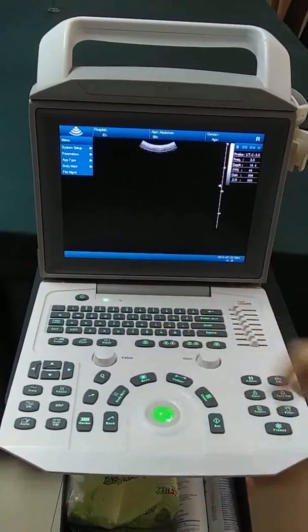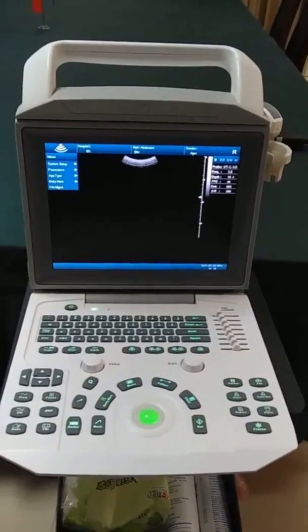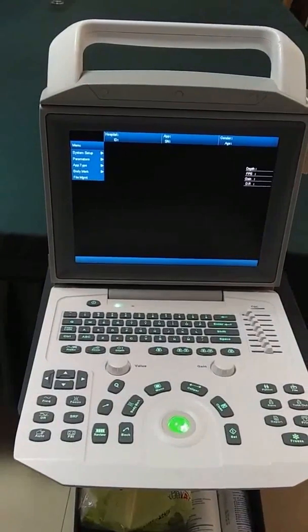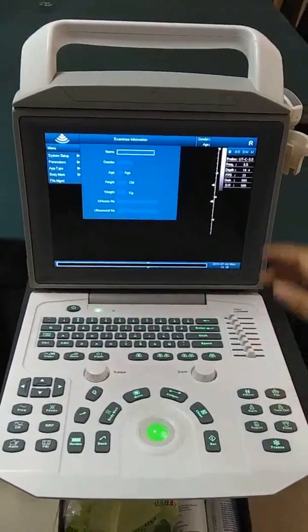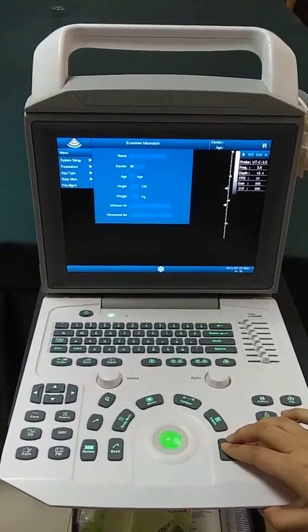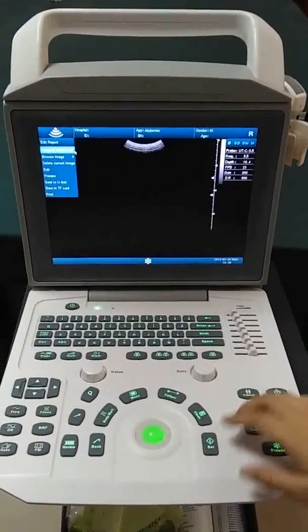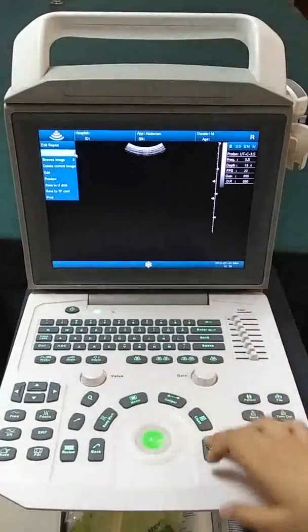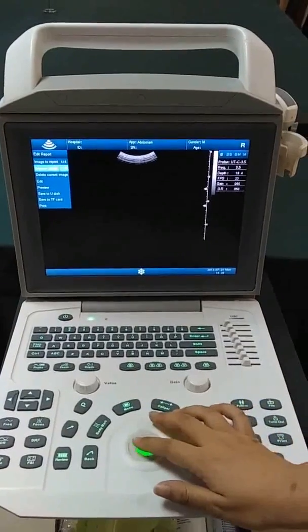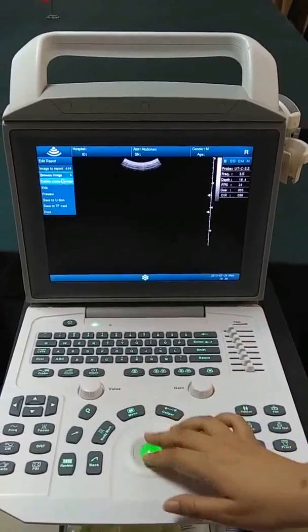Now we come to B mode to examine a patient. We just need four steps: first, choose a probe; second, input the patient's information; third, perform the examination; and fourth, generate the report — save images to the report, then browse and edit the images.